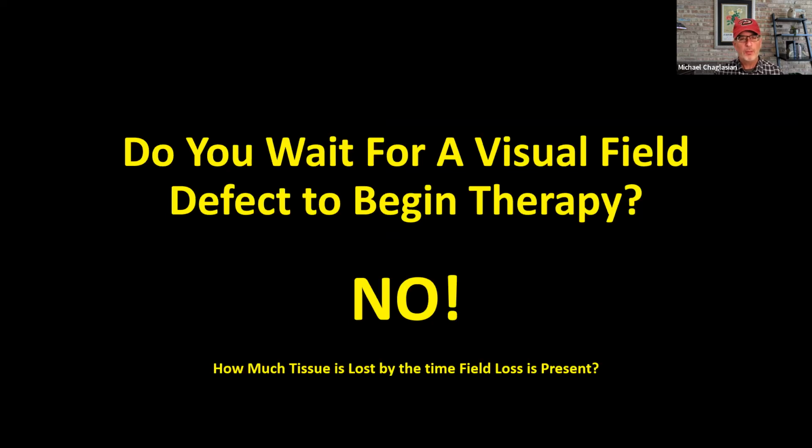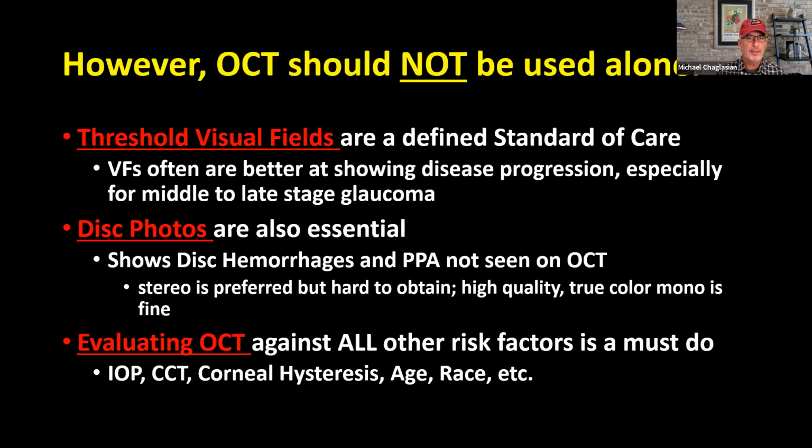Well, I just wanted to, again, put this out there that this is not the case, and I'm going to show you some evidence why in just a couple of slides. OCTs really do lead the way for us in making a diagnosis, but they are not the only thing. We should never really use them alone. I'm encouraging everyone on the call to make sure that you're using your OCT in conjunction with your threshold visual fields. Disc photographs are also essential.